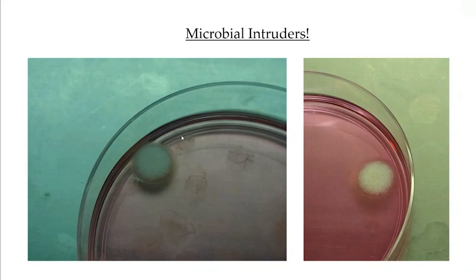The slices tend to float near the surface of the media. It took a week to get to this. But then you have a fungal infection growing, and you'll generally have to dispose of the plate. It will be almost impossible to remove the fungus and preserve these slices once this plate has become infected.